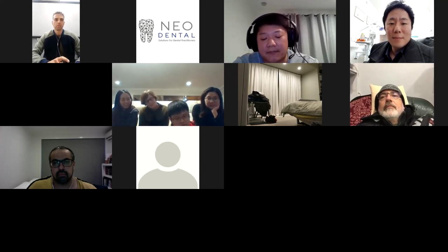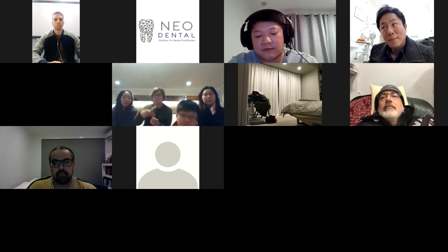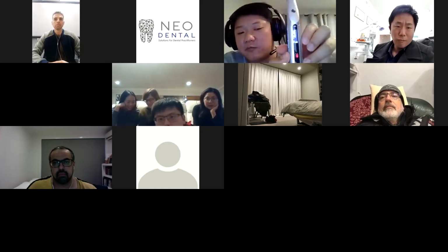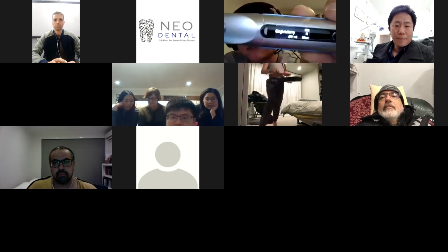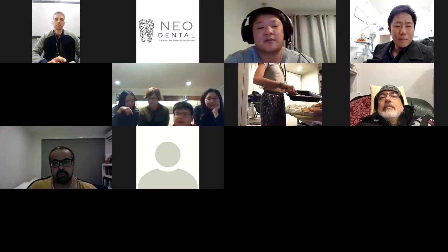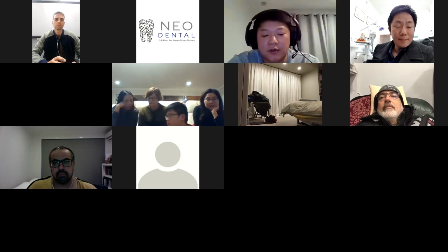And then also, once you're in there, I'll just go back to the setting for you. So if we go back into this, and you want to, for example, change the power output, when you've got that setting on, you just tap the circular button once, and then the power 1.4 watt is blinking, and then you can use your arrow keys to go higher or lower. You don't have to go back and reset everything else. So that's a way to adjust things. And then you can also change your pulsed modes or your manual modes by cycling through.